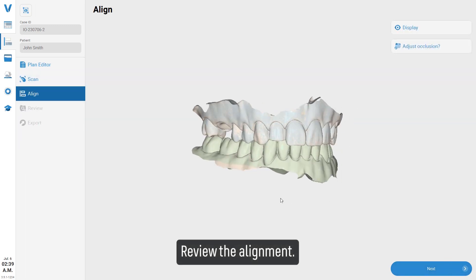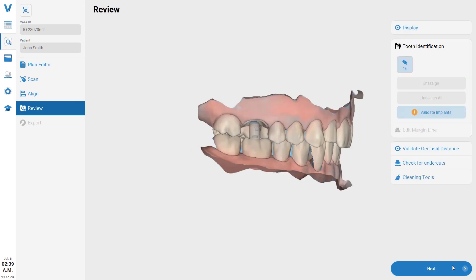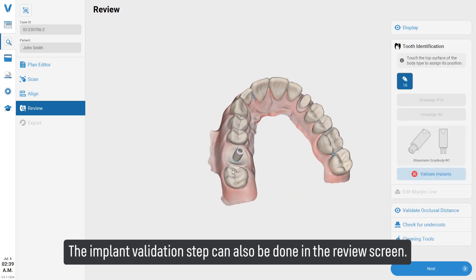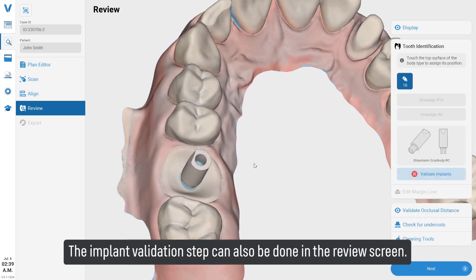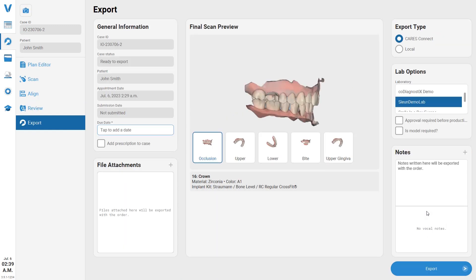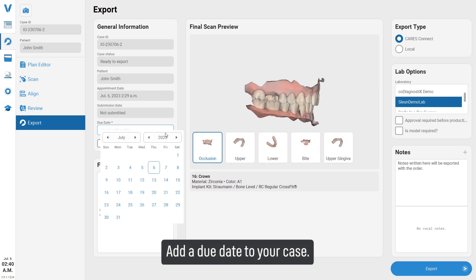Review the alignment of the arches. The implant validation step can also be done in the review screen.